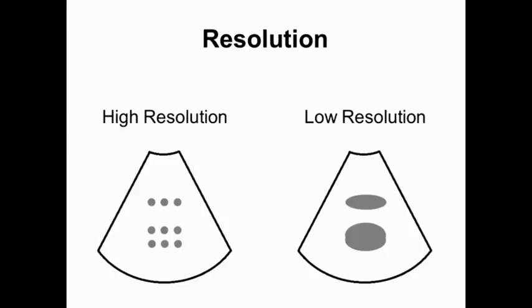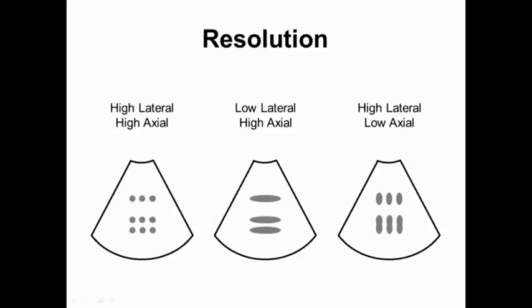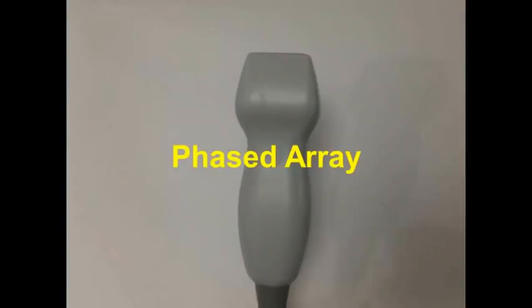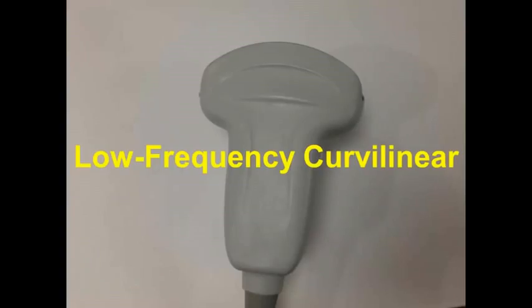Resolution is the ability to differentiate between distinct objects. It can be further broken down into axial and lateral resolution. High-frequency waves achieve better resolution than low-frequency waves. The high-frequency linear probe has good resolution and poor penetration. Common uses include vascular access and lung ultrasound. The phased array probe has a small footprint that is helpful for viewing structures in between ribs. Common uses include echocardiography and the FAST exam. The low-frequency curvilinear probe has good penetration and a large field of view, making it the probe of choice for abdominal exams. The good penetration of low-frequency probes comes at the expense of resolution.